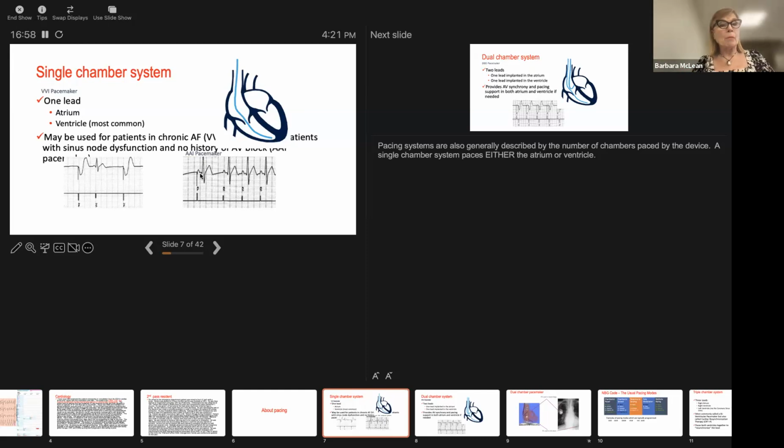So here's the thing I want to talk about when you talk about atrial pacing. When you atrially pace, a lot of times you won't be able to see the P wave, but if you have an A-line, you should always be monitoring stroke volume. If you're pacing your atria appropriately, the atria will contract and squeeze blood down into the ventricle, and that will profoundly affect your stroke volume. It could be up to 30% of ventricular filling.